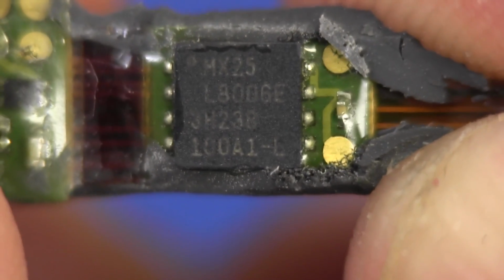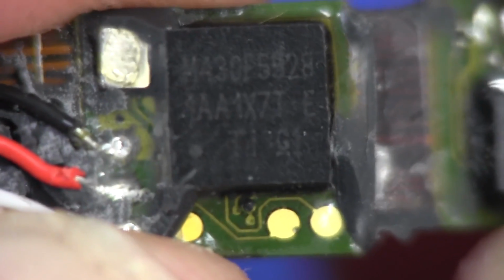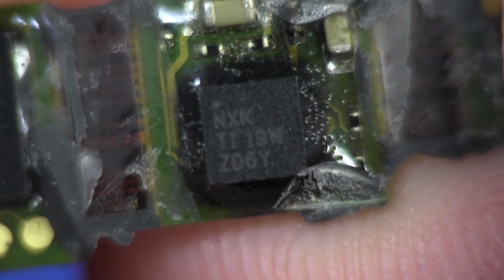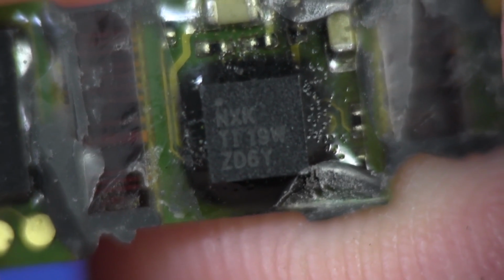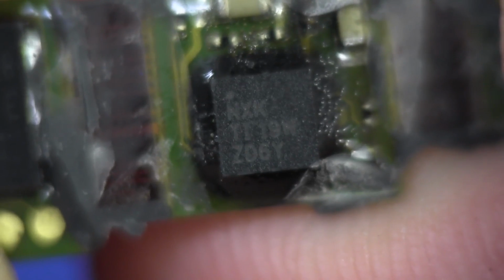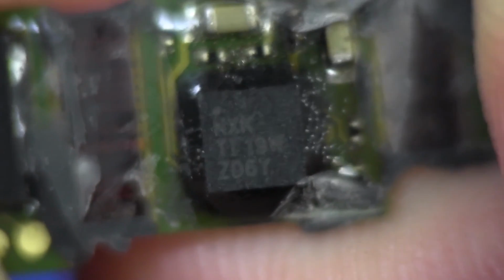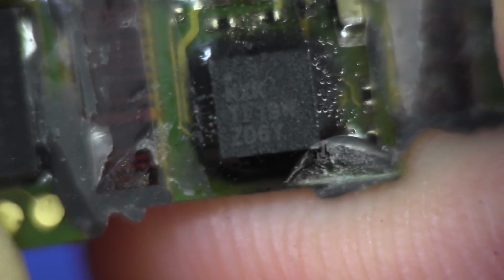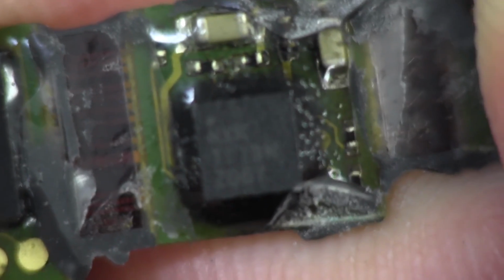It's not a BGA, so that one's not as hard as the main processor on here, the MSP430. So, these rigid flexes combined with BGA and double-sided load and everything else, what a pain to assemble, really. And that chip there, I was able to find the info on that. The NXK TI19W was what it's marked there, but it's actually a Texas Instruments BQ24230. You guessed it, lithium-ion/lithium polymer battery charger IC, because that's the only other thing needed that we haven't found yet. So there it is.